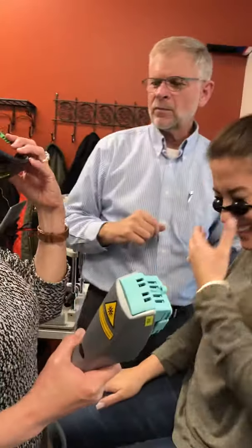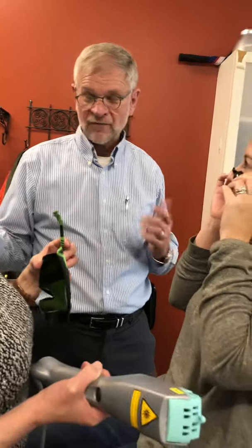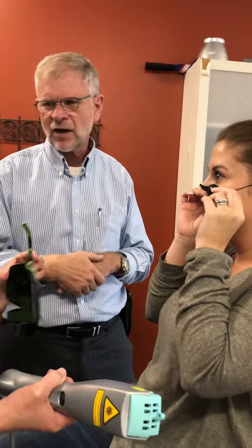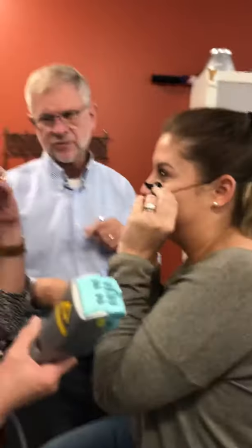I'll volunteer for you. Once you have your alignment, if you didn't have the goggles on, you just kind of look askance, push the button. I treat all the time without goggles. Close your eyes, because I've always got somebody else looking at it.